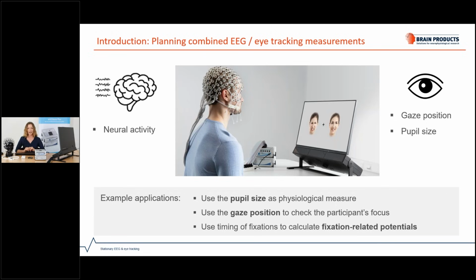And the third example I have is that eye tracking gives us very precise timing information about when some point on the screen might be fixated.